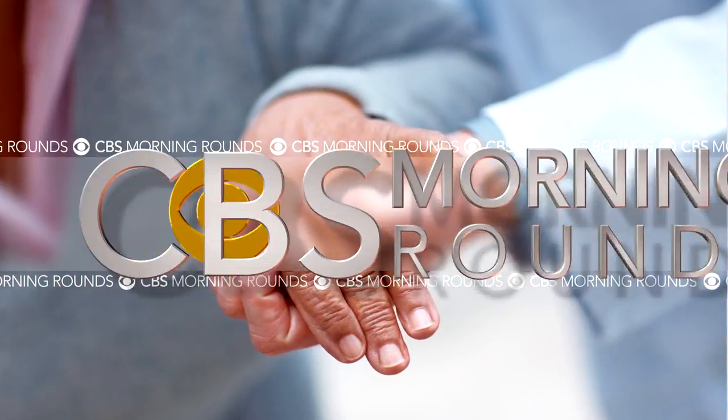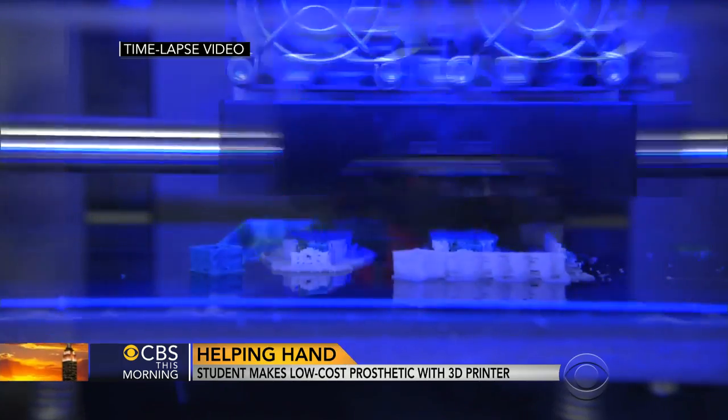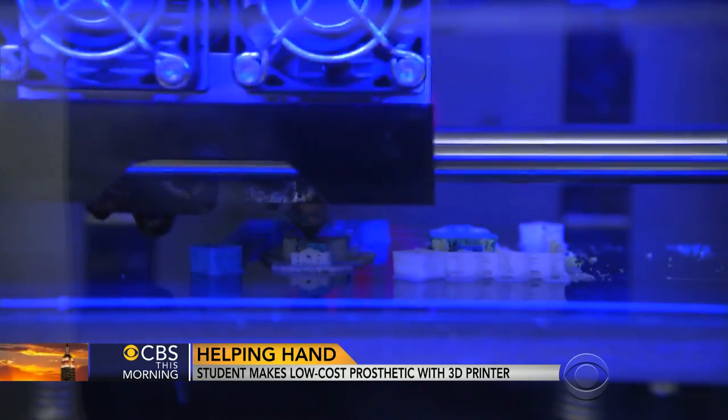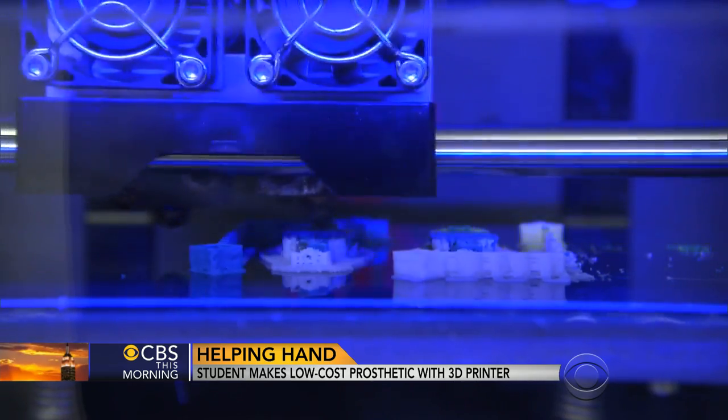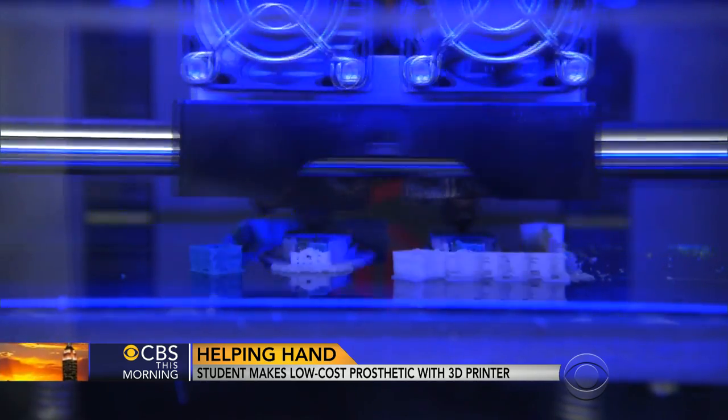In our morning rounds, reaching for the future, a North Carolina college student created prosthetic hands for kids. They cost a lot less than regular models. Here's the amazing part — he did it using a 3D printer. Anna Werner shows us how the invention dramatically improved life for one little boy.